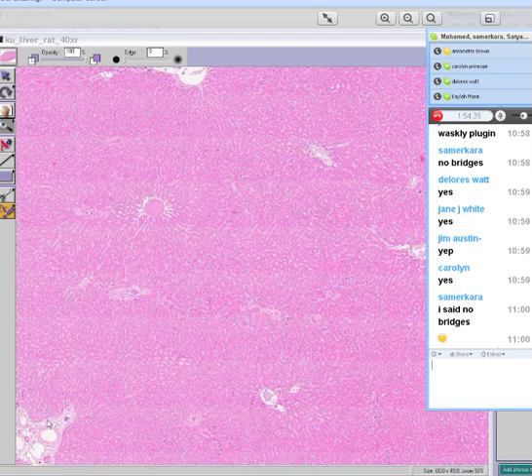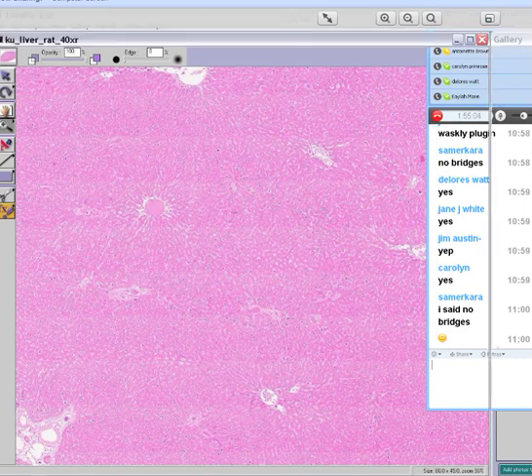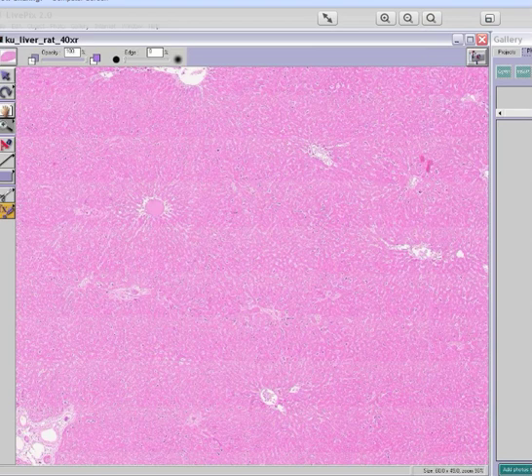And that's all that I have to say. You already know how to recognize fat. You already know how to recognize bile. You already know how to recognize hemosiderin. So whenever you look at a liver, and they might throw in a picture of some liver disease, hopefully a common one, just remember, make sure there's a regular interrelationship between the central veins and the portal veins, and the connective tissue is limited to the portal vein area. Those are the two things. And we're done for today, by the way, because it's 11 o'clock.